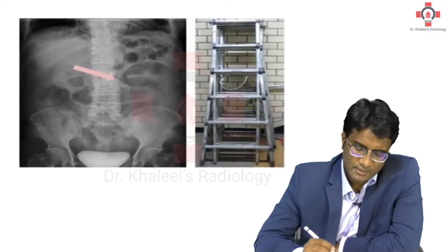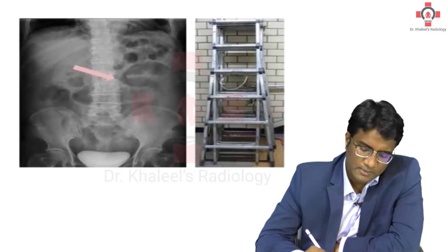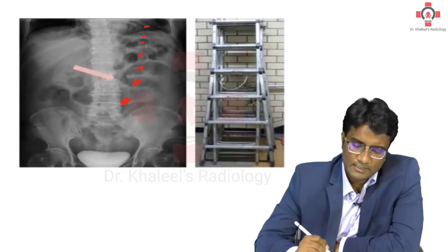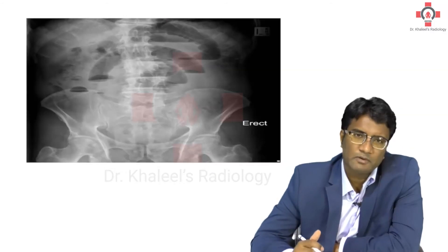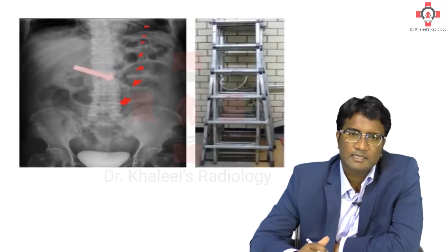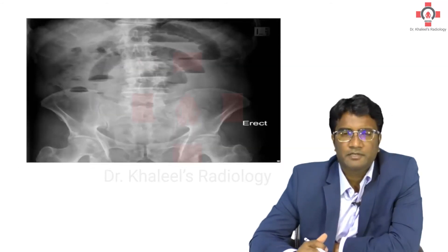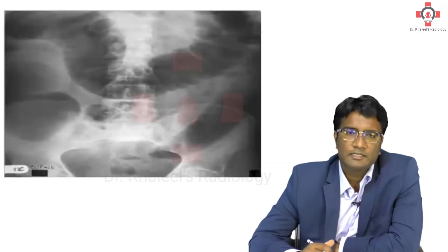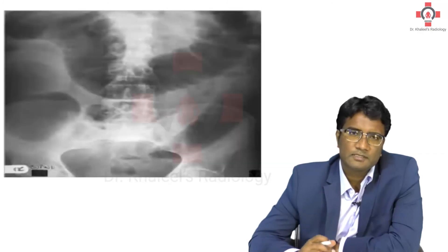Please look at this image. You can see the bowel loops present one above the other — this is called the step ladder pattern. When you see bowel loops stacked one above the other like this, that is the step ladder pattern, which is a feature of small bowel obstruction.